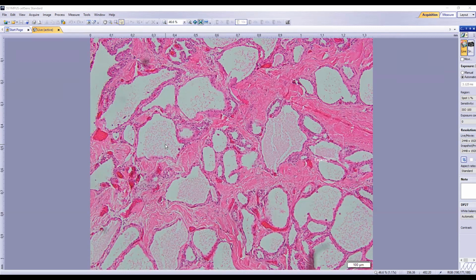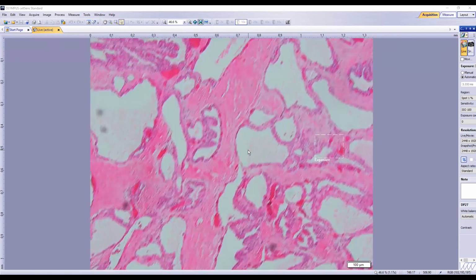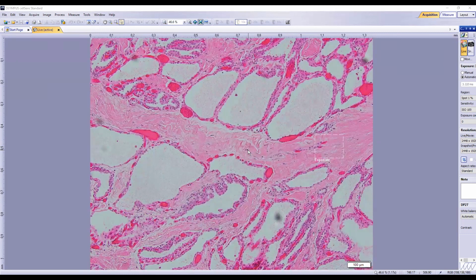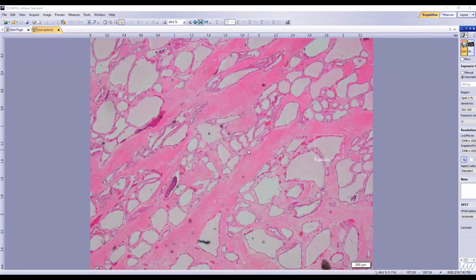And so where else would you see that mutation? What other tumor in the body? RCC, renal cell carcinoma, right? And hence the morphology. See all these small punctate blood vessels, like capillaries? That's something that you would see in RCC, right? So histologically, that's something that can remind you of the RCC architecture. But regardless, this is a microcystic serous cystadenoma.